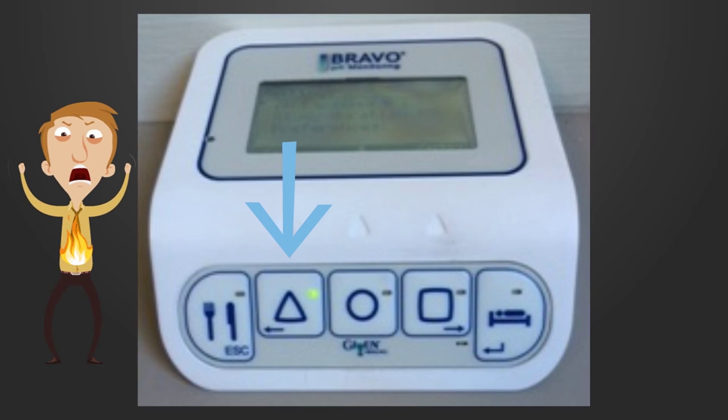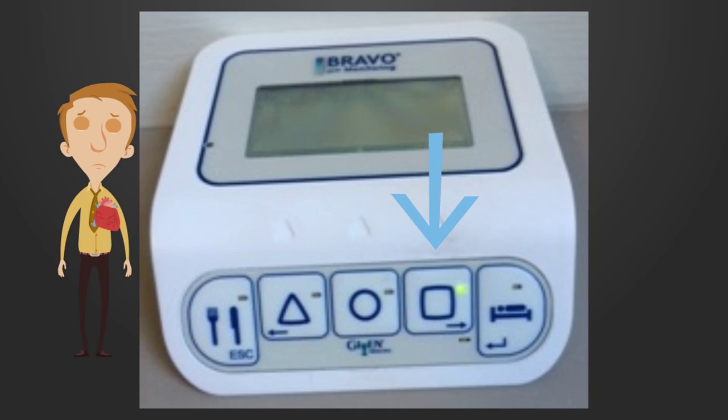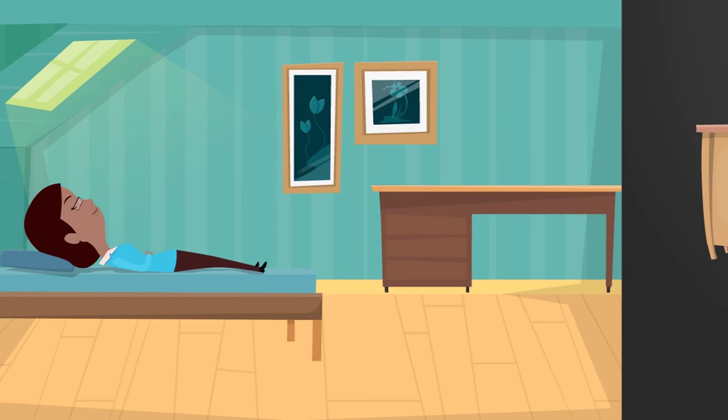Here's how to record your symptoms. If you have any chest pain, press the triangle symbol once. If you experience any regurgitation, press the circle symbol once. And if you feel any heartburn, press the square symbol once. If your symptoms are different, we can reassign the buttons to match your specific needs. Lastly, keep track of when you lie down — press the bed button at the beginning and end of your rest period.